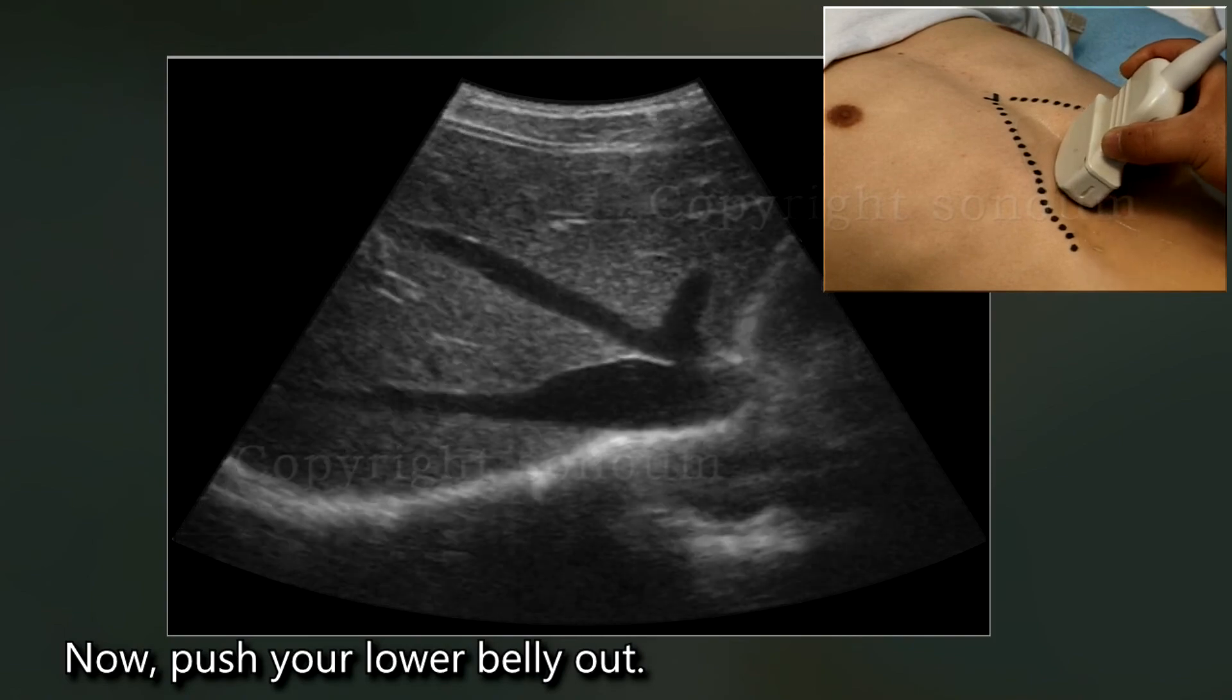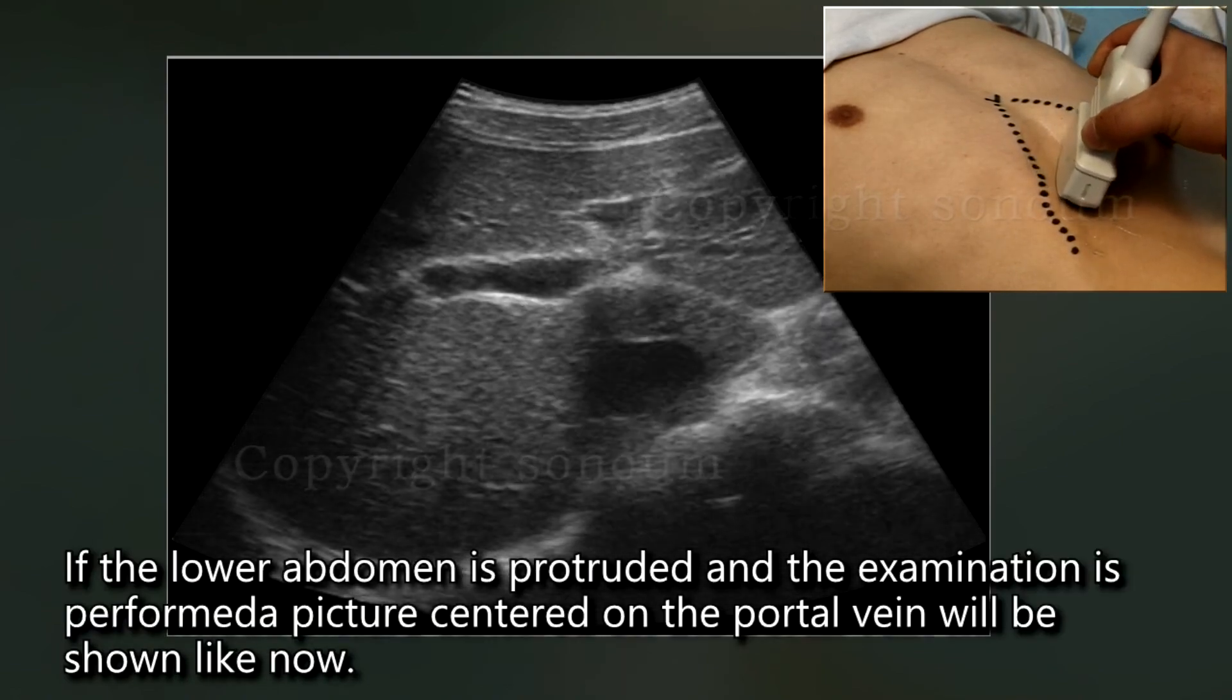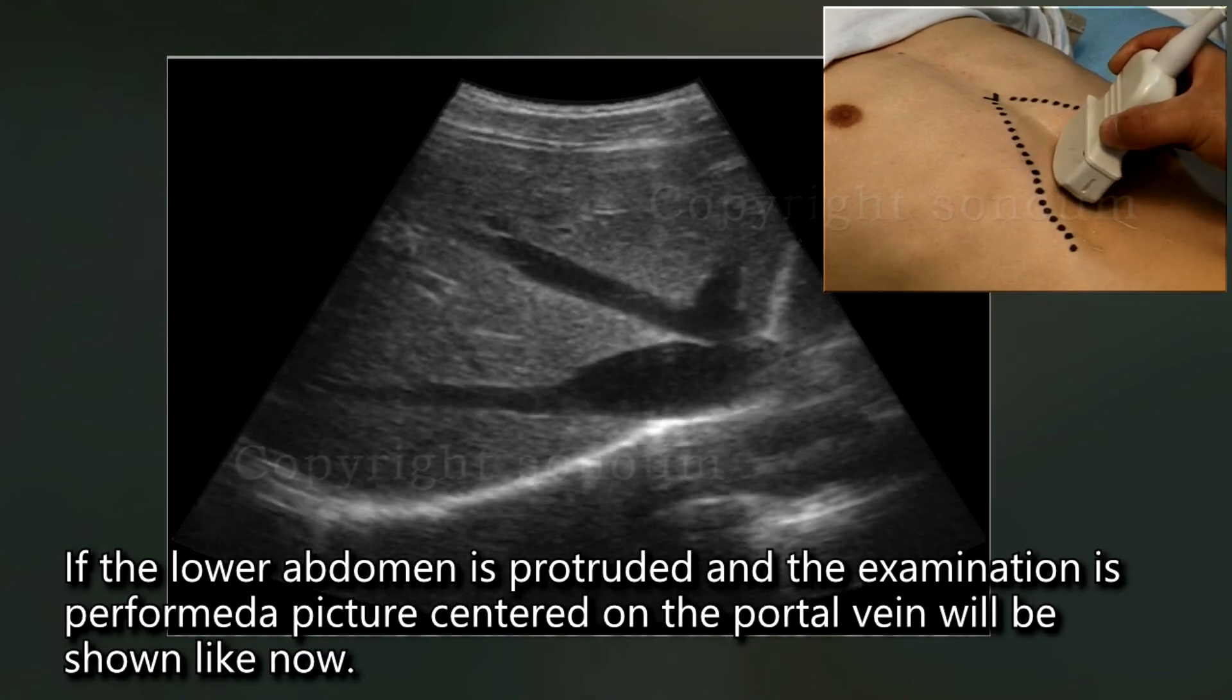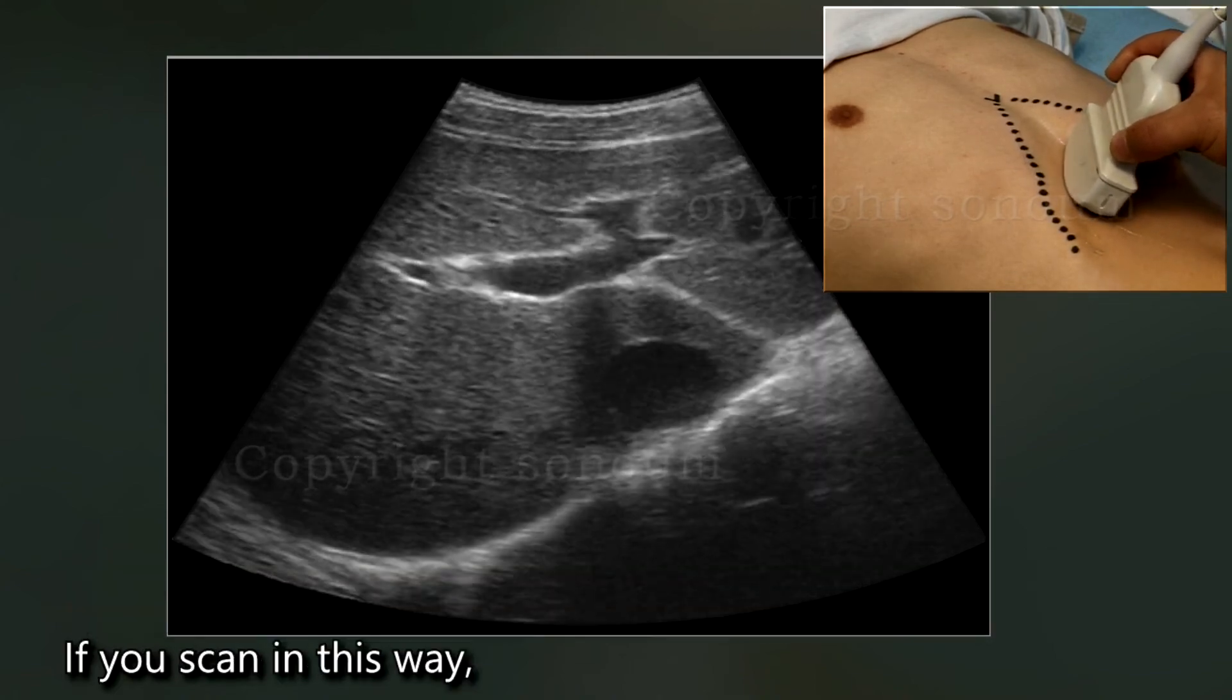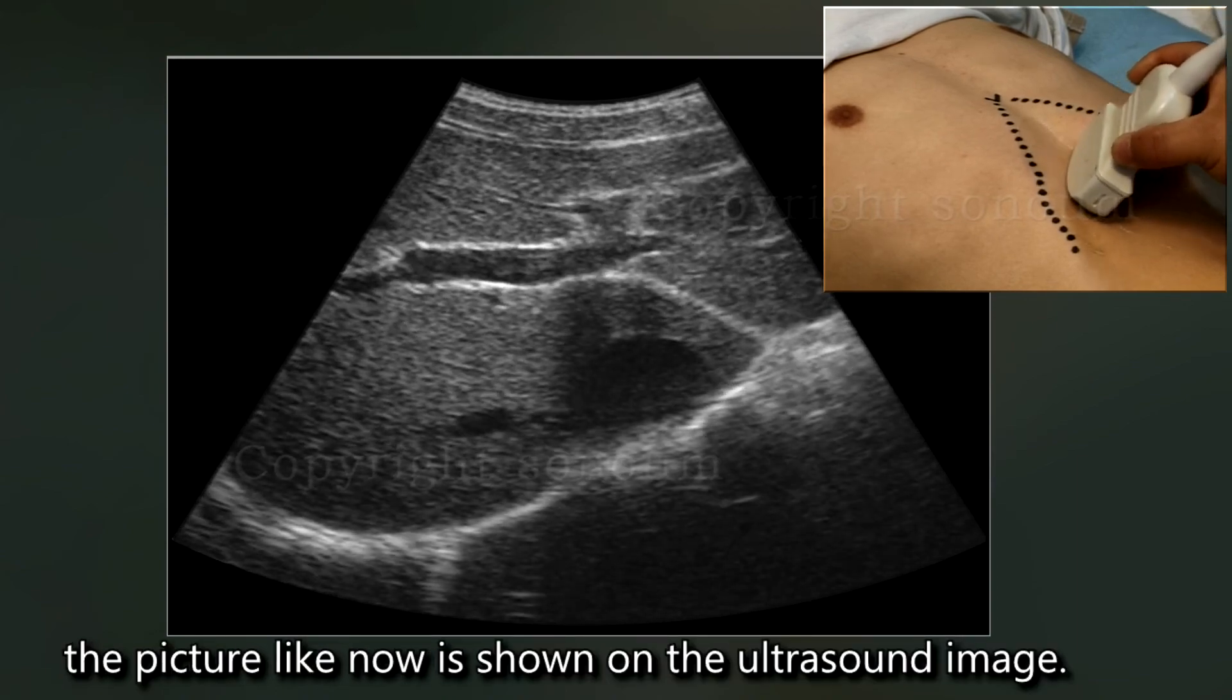Now, push your lower belly out. If the lower abdomen is protruded and the examination is performed, a picture centered on the portal vein will be shown like now. If you scan in this way, the picture like now is shown on the ultrasound image.